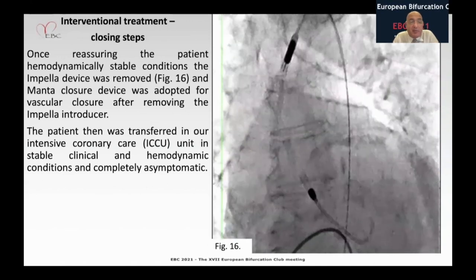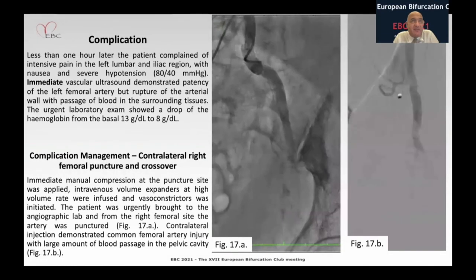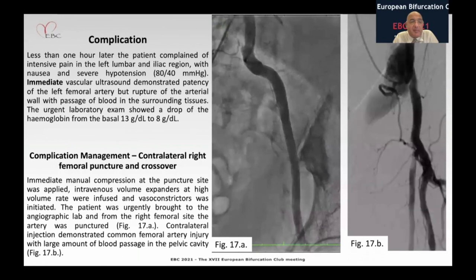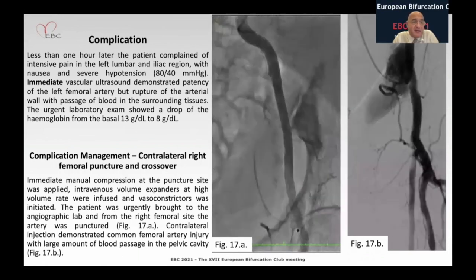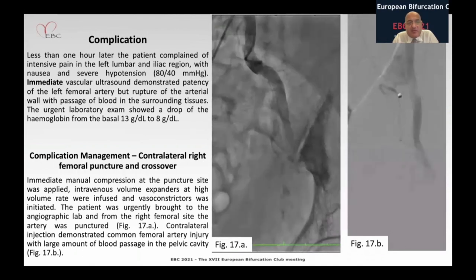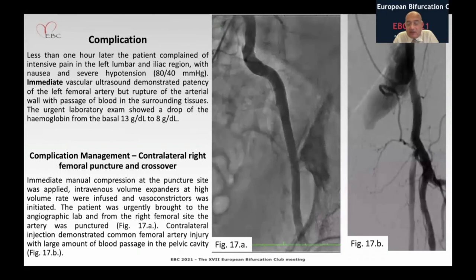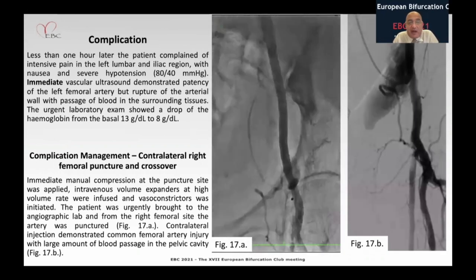The patient was then transferred to the coronary care unit. Exactly 5 to 10 minutes later, the patient complained of intense pain in the lumbar and iliac region with severe hypotension, and the immediate vascular ultrasound demonstrated a rupture of the femoral artery.